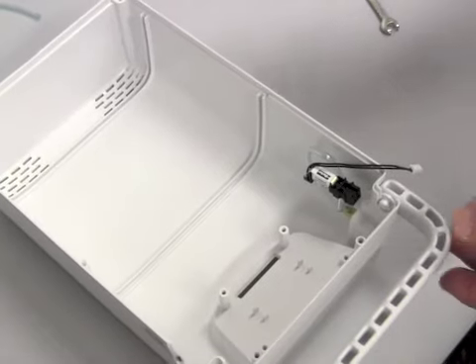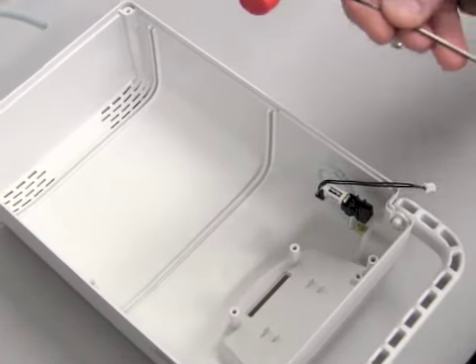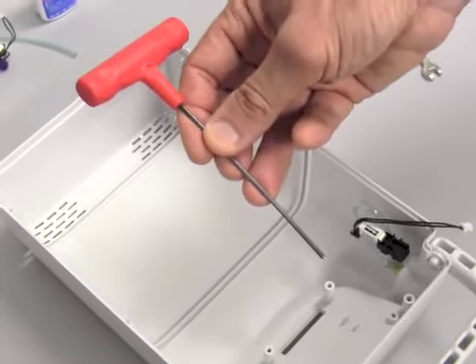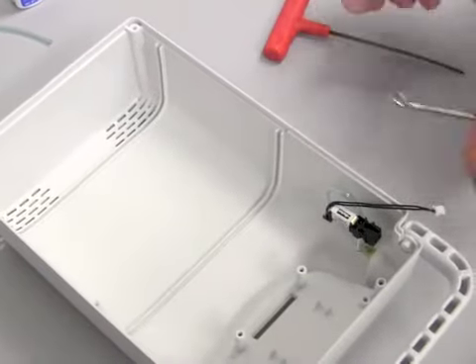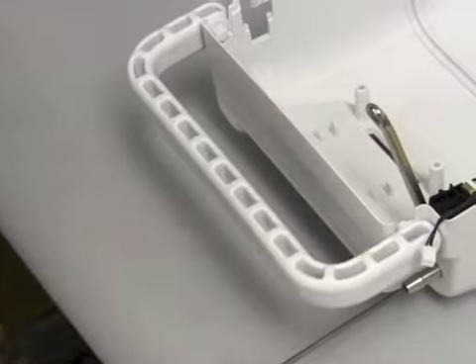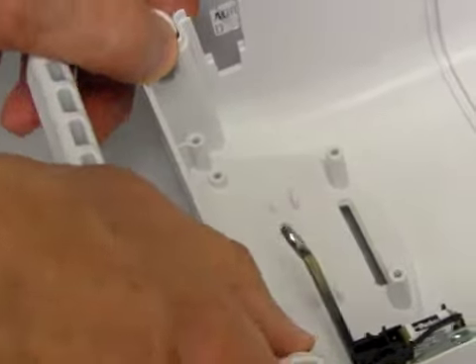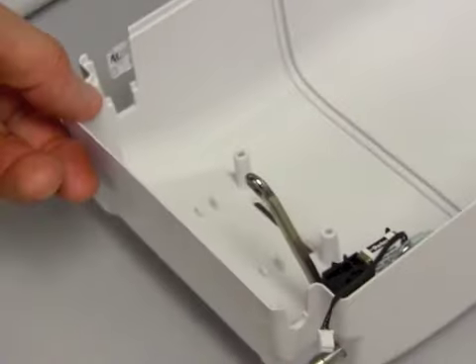The last step in disassembling the POC is to remove the valve. This is done by using a 3/32 Allen wrench and a 1/4 open end wrench. To remove the valve, the first thing you want to do is get the handle out of the way for the POC. So we'll just take the handle and set it aside.